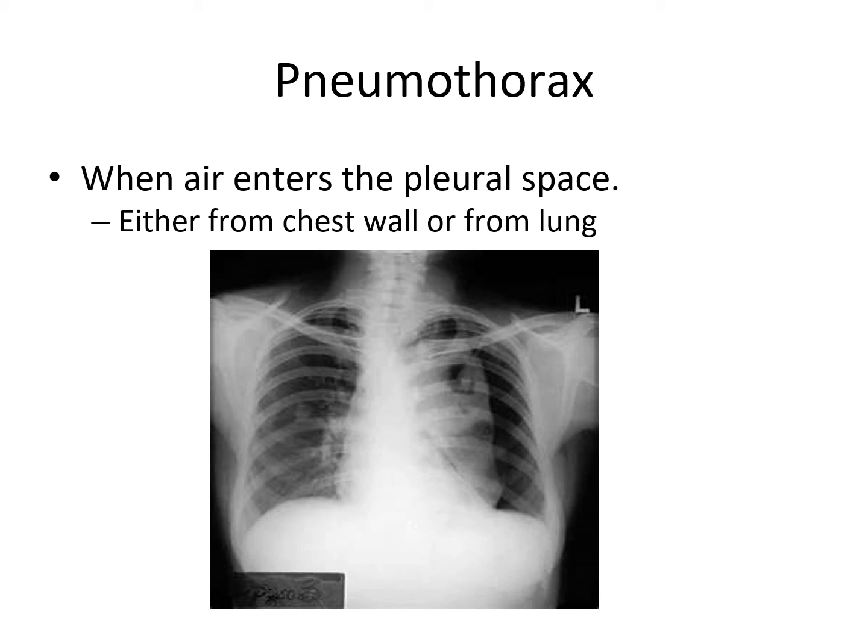So here is a picture of a pneumothorax. Definitely on the left side. Here you can see on this x-ray that there's actually an L, so that's telling us that that's the left side, so that's always helpful. But you can see how the darkened area here, let me see if I can get my little pen again.